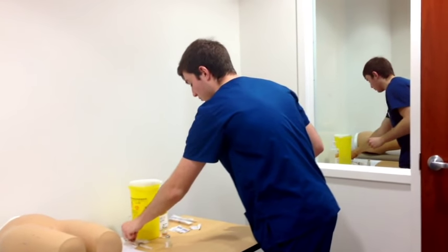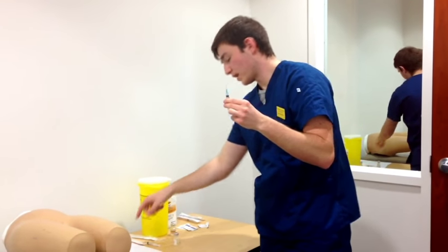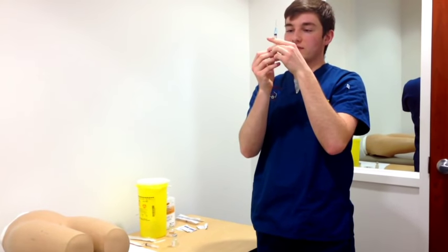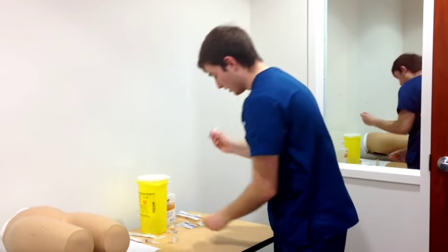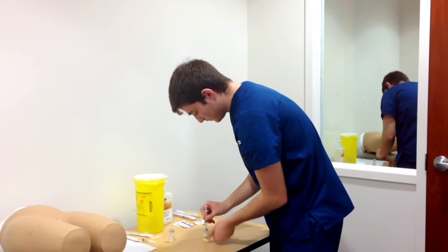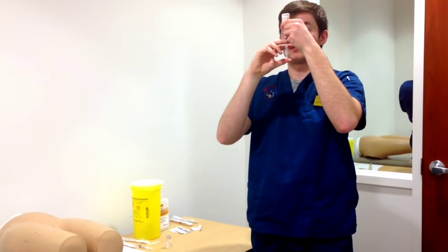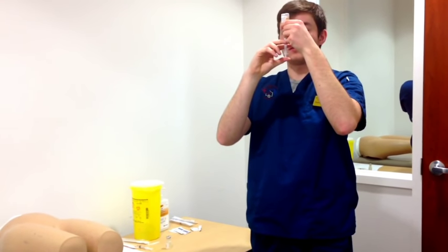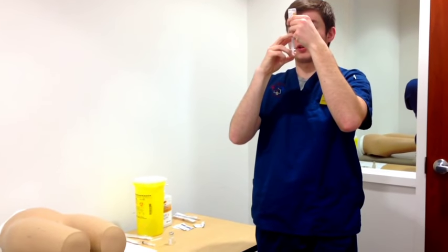I will then do the same for intramuscular. Again, just making sure that I have the right dosage, 0.5. I'm just going to be drawing up 0.5 milliliters of air. Like a dart, putting into the Haldol vial. Then injecting the air into the vial. Based on negative pressure, it will break out. Again, making sure I don't touch the inner plunger.